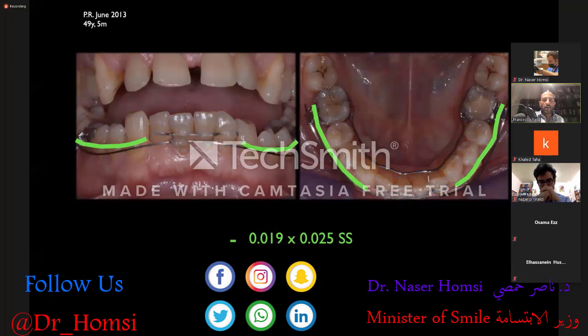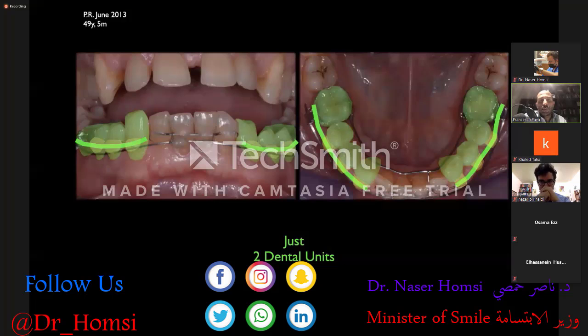The incisors are intruded, discharging the reaction forces on a posterior block of teeth created by using a 19x25 stainless steel wire on the first molar, second premolar, and canine as well, connected together, and the 19x25 stainless steel is bonded with flow resin to the enamel of the corresponding teeth. A 17x25 TMA intrusion arch, as we have seen together, tends to intrude the incisors, as we can see here in the drawing.